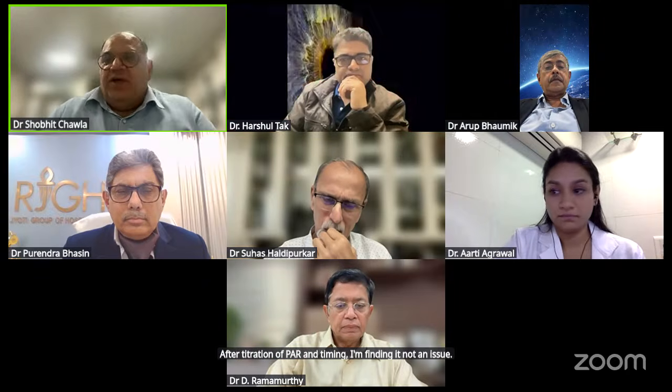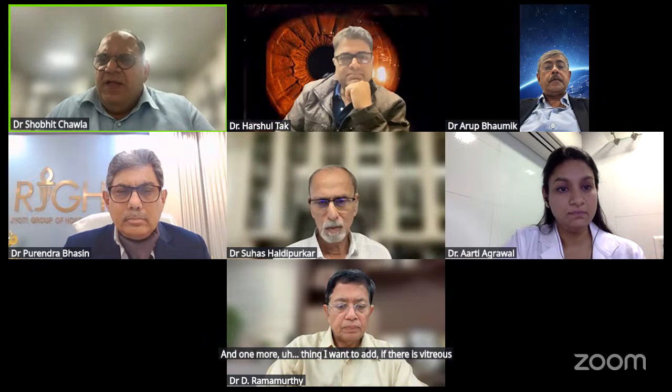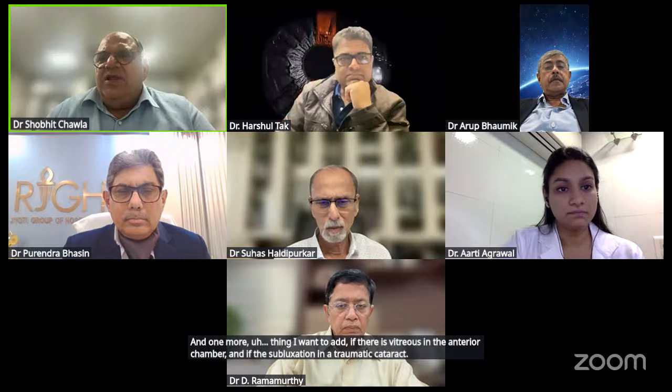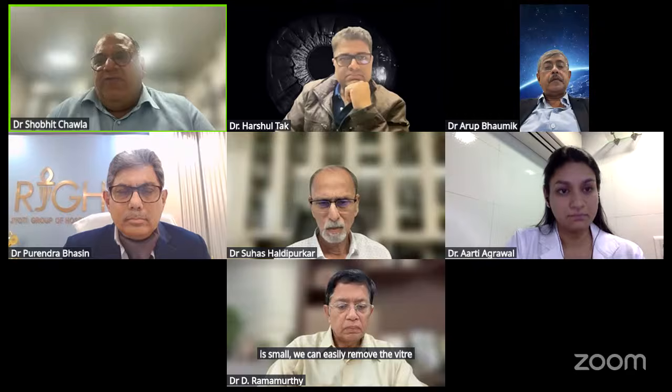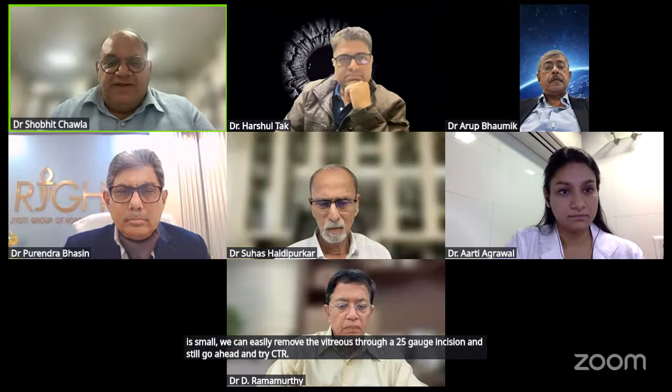And one more thing I want to add: if there is vitreous in the anterior chamber, and if the subluxation in a traumatic cataract is small, we can easily remove the vitreous through a 25-gauge incision and still go ahead and try CTR. Thanks. Can I have answers?